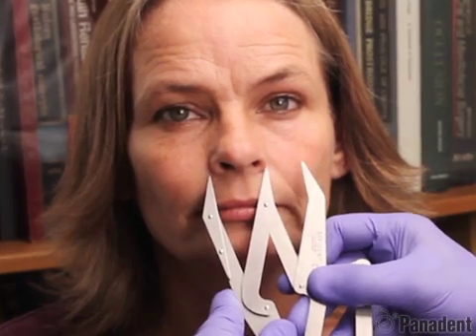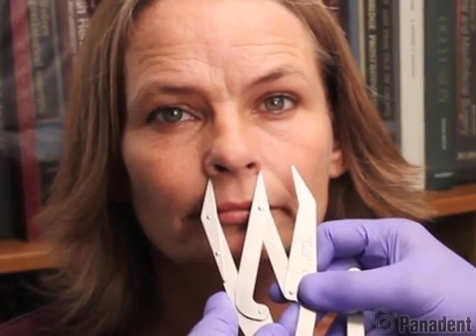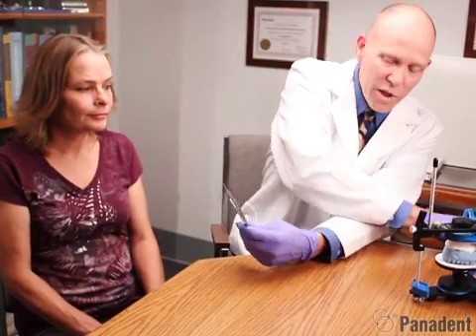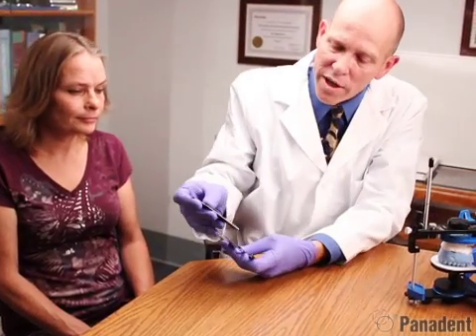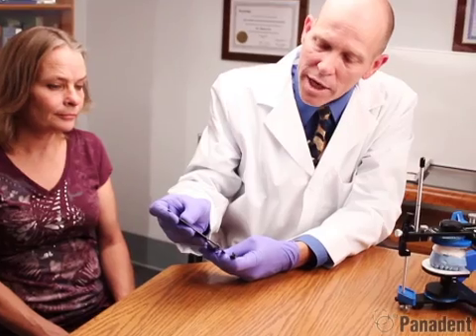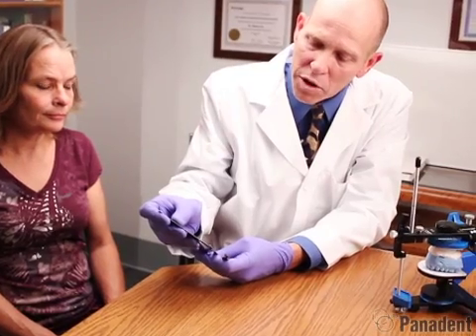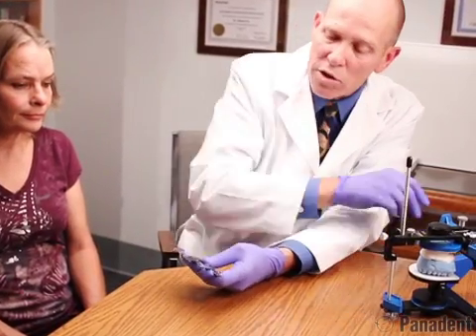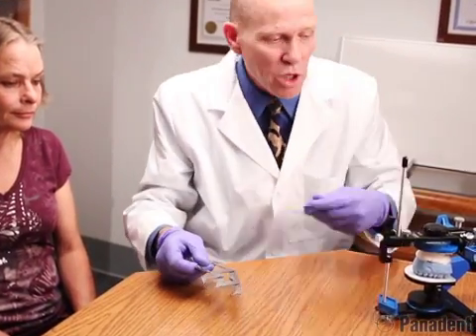Then we re-evaluate the width of the nose, which will give us the width of two central incisors. Once we have that, we can measure that distance, which is 18 millimeters. We divide that by two, which would be 9 millimeters.